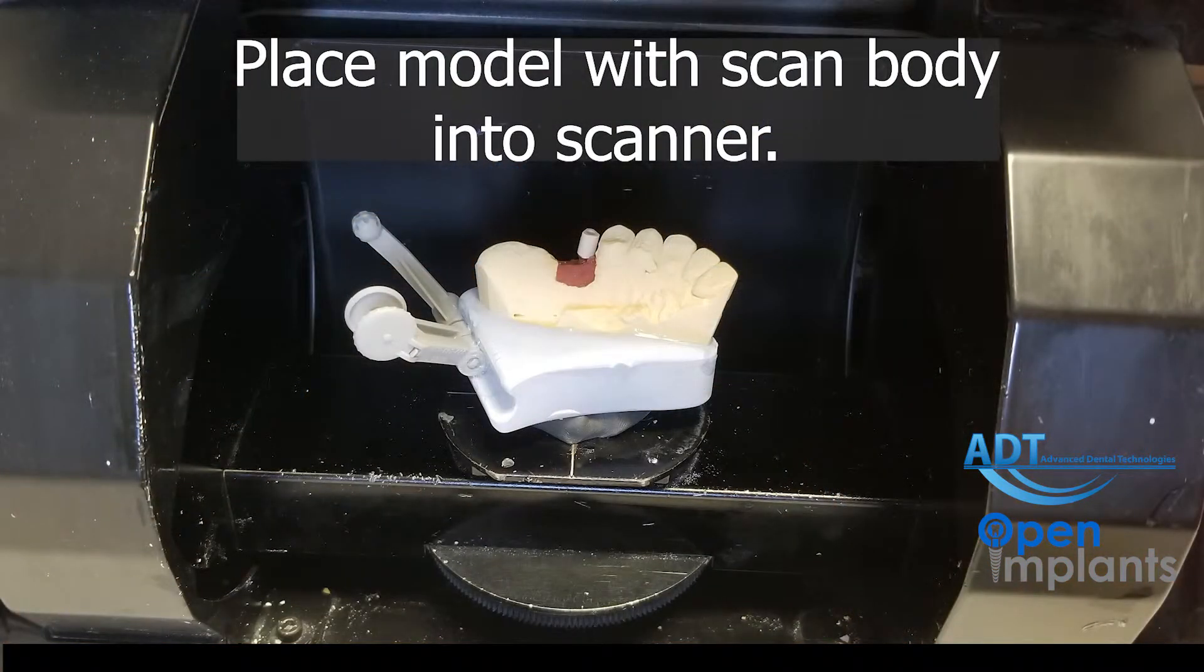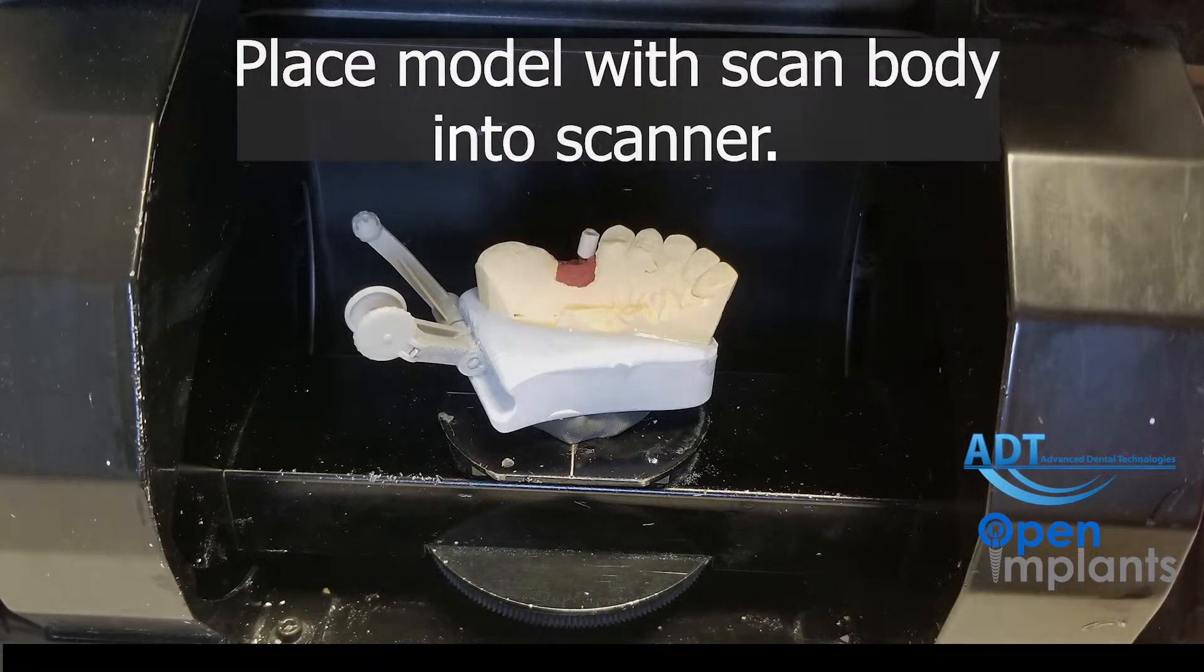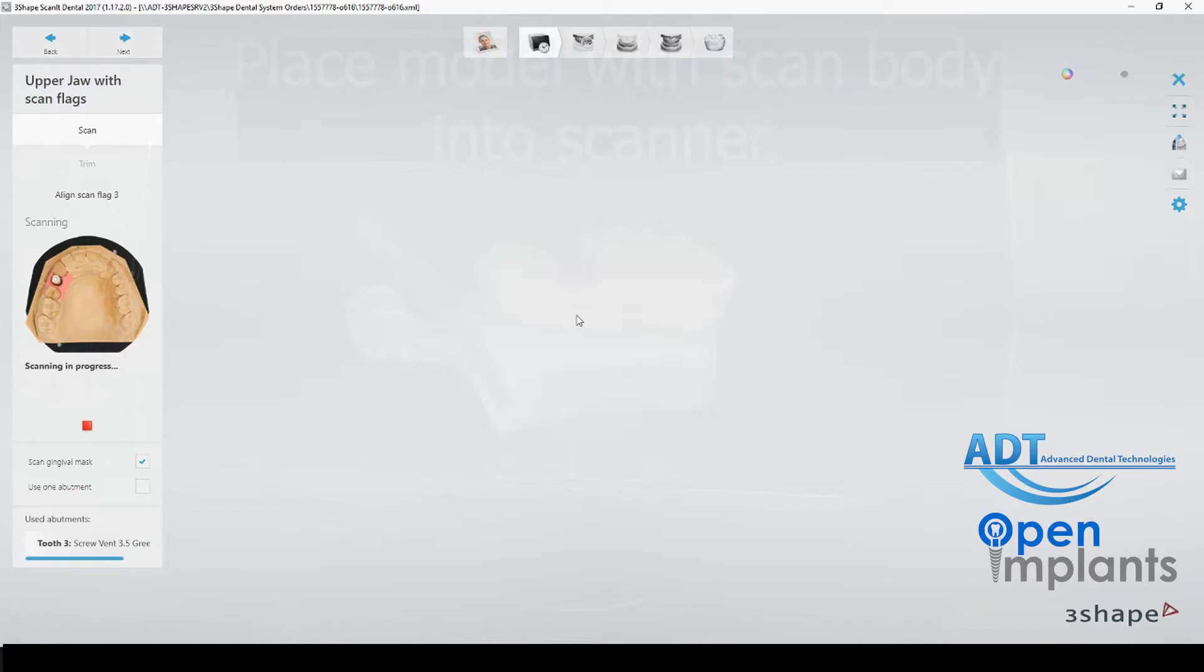We have the model in the scanner ready to go. You notice that we do not need to use CAD spray or powder. The top part is made of a PEEK material which is great for scanning. The bottom of the scan body is metal which is for durability and you can see through a radiograph if using intra-orally.